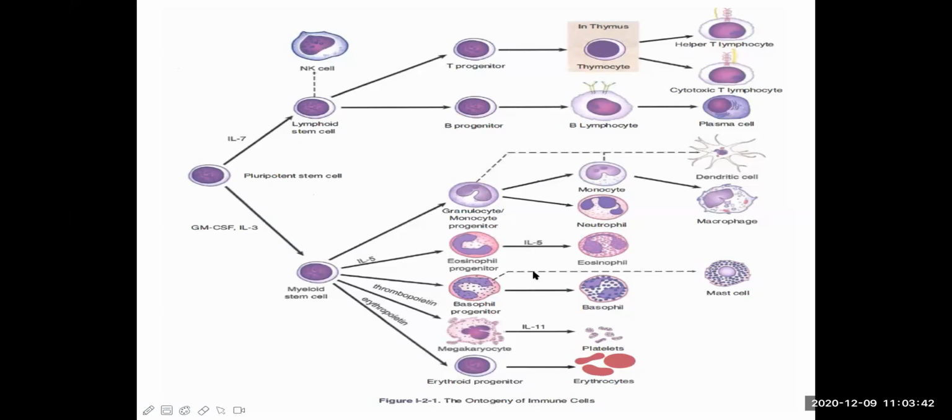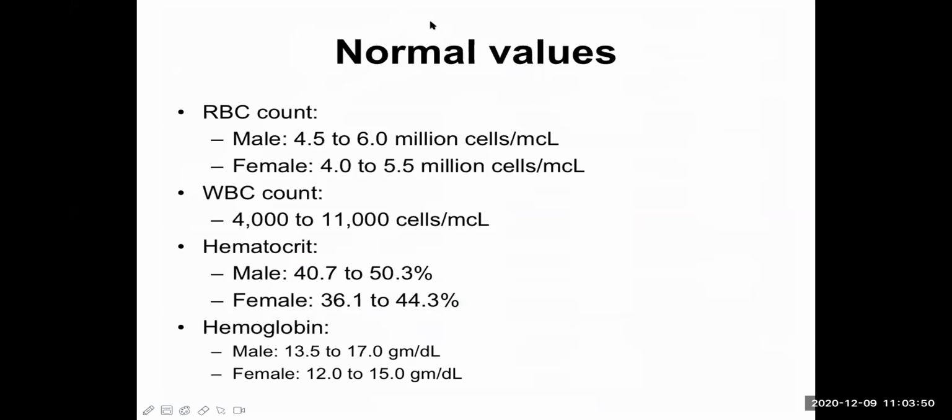You don't need to really remember these different cytokine, okay? It will be known later on. Now, let's move further. Let's talk about what are the normal values of these different cells under CBC. Please pay attention.